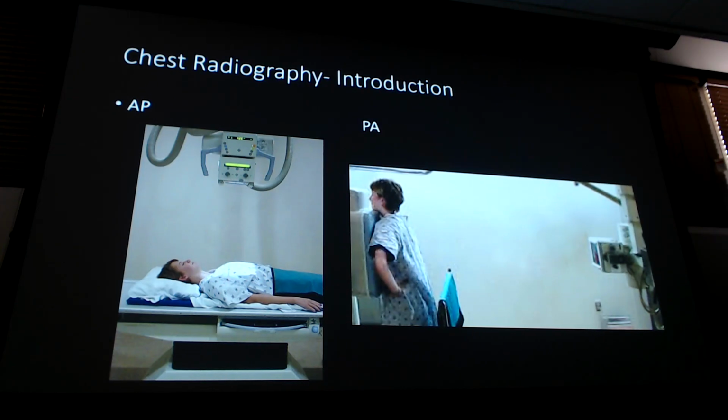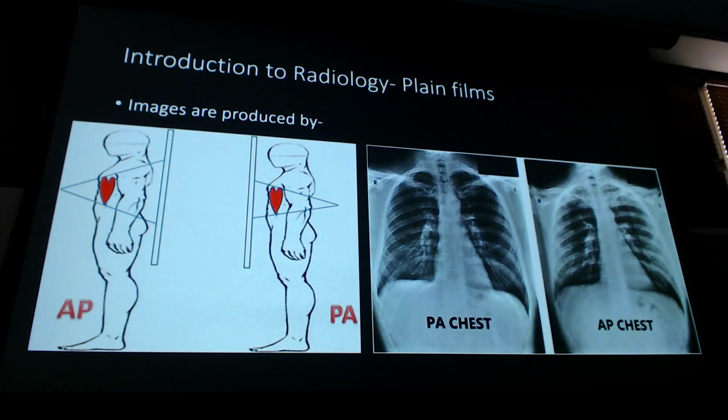I will not expect you to interpret by looking at the X-ray and figure out on your own whether it's PA or AP. I will not. But I do need you to understand some of the abnormalities that can happen with the AP, i.e. the magnification of the heart, because if you have an AP X-ray, I will tell you it's AP. So that way you know in your brain, hey, if that heart looks a little bit larger than it should when we go over what the size of the heart should be, oh, it's an AP X-ray. I expect that. That's not an abnormality. That's okay. But I'm not going to give you one and expect you to know. Because like you can see here in this picture, like I told you, before you see the image, we're going to flip it to the way it's supposed to be for you.